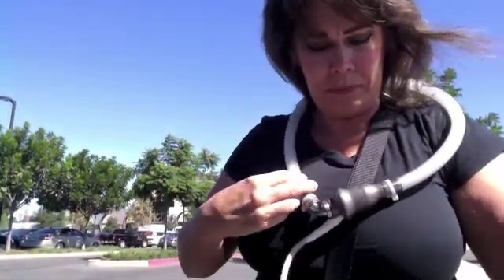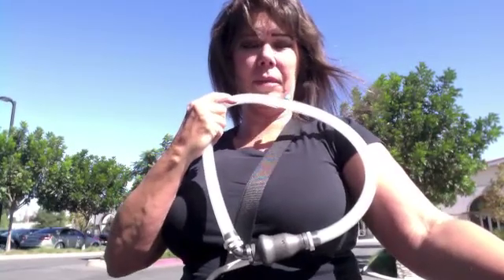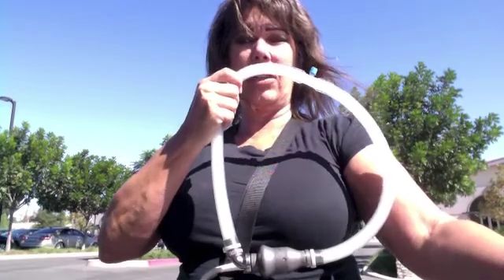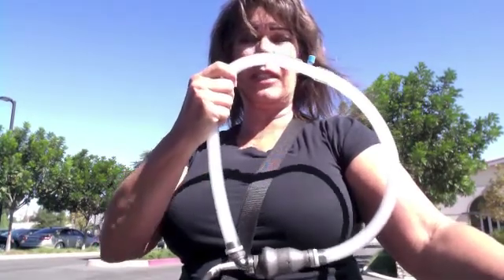So here's the pump that's inside my chest. It's down probably like this, underneath the left ventricle and into the aorta. This actually has water in this tube, and it's pumping it continuously to show how blood moves around inside the body. Here's the little controller.